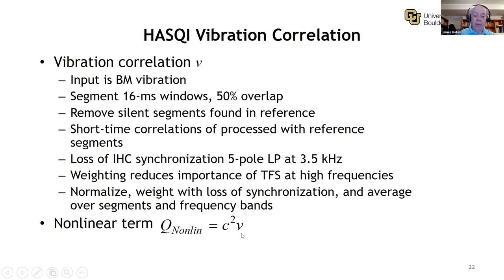And our nonlinear model is C squared times V. This is a completely empirical fit. There is no theoretical justification for it, other than it seemed to do a really nice job representing human subject data.